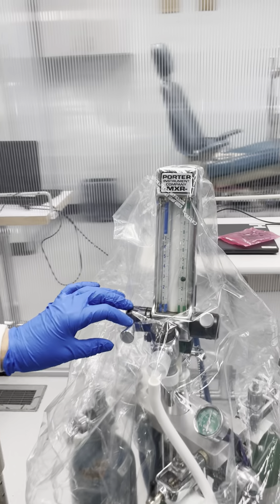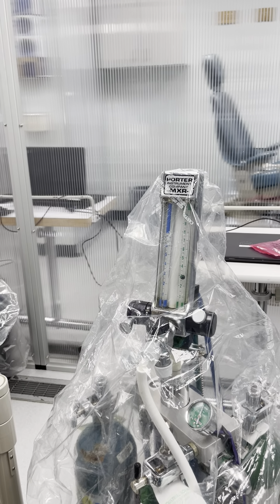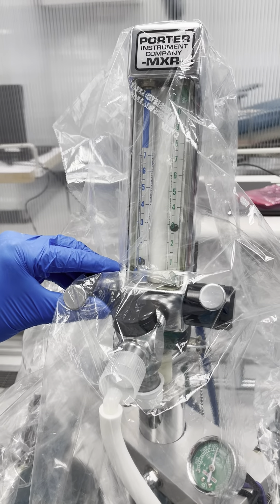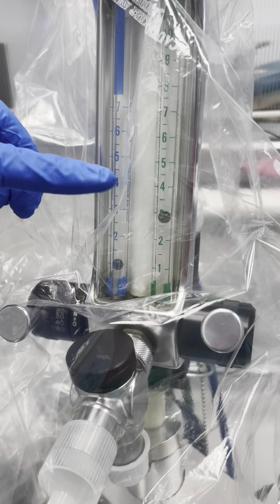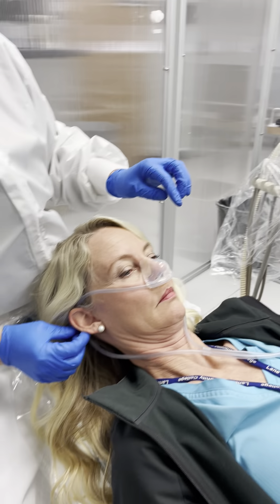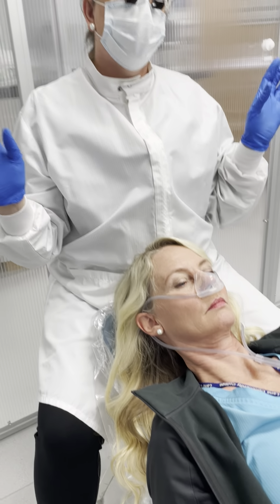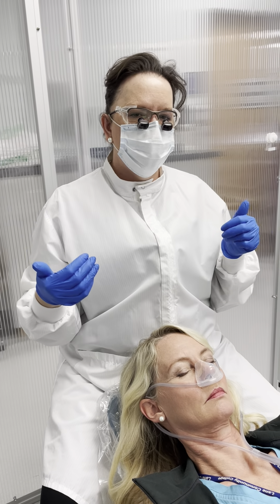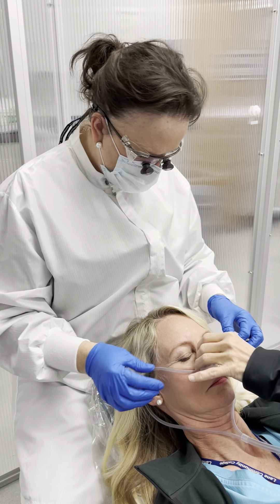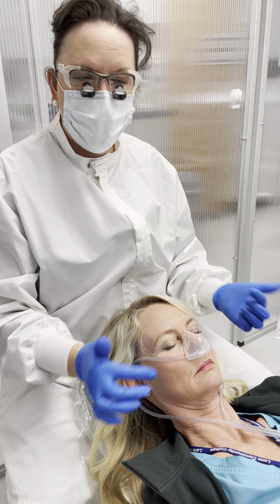Now that the patient is prepared, we can go ahead and start titrating. We never go straight to the percentage the patient was at before — we want to bring them up to the appropriate level for that patient on that particular day. Typically we start with one liter of nitrous first, then increase in half-liter increments. So now she's got 3 liters of oxygen and 1 liter of nitrous.